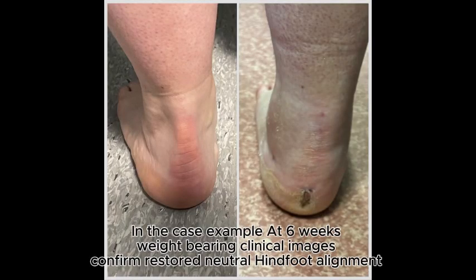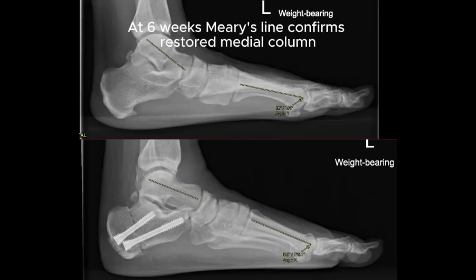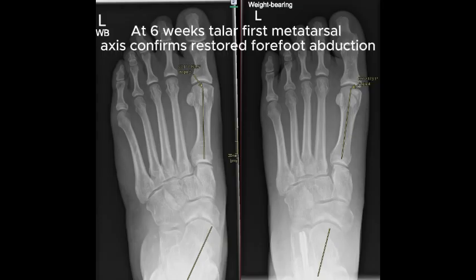In the case example at 6 weeks, weight-bearing clinical images confirm restored neutral hindfoot alignment, restored medial longitudinal arch. Meary's line confirms restored medial column. Talar first metatarsal axis confirms restored forefoot abduction.